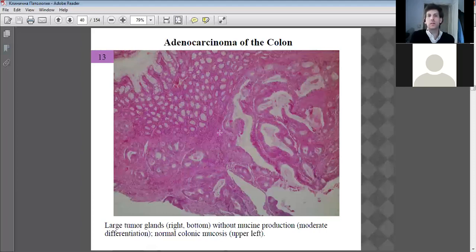The tumor seems to have started up this end here, and it's sort of migrating its way towards the surface here, okay, causing massive destruction of parenchymal tissue. Some examples of normal tissue there, but breakdown there, large spaces, lots of cellular debris, a bit of bleeding.